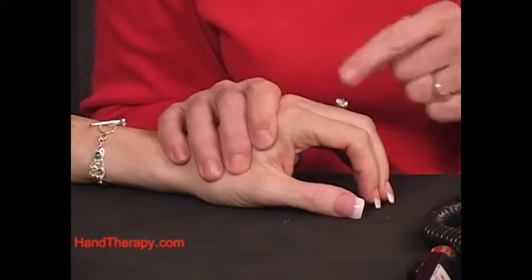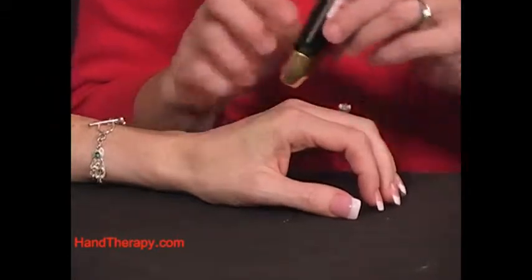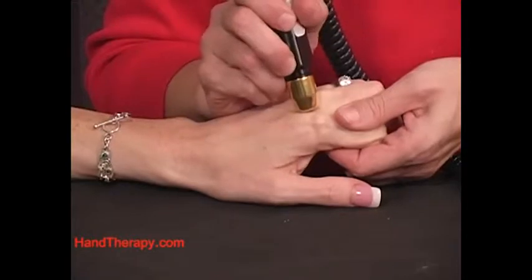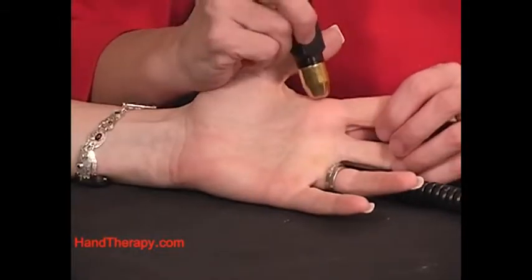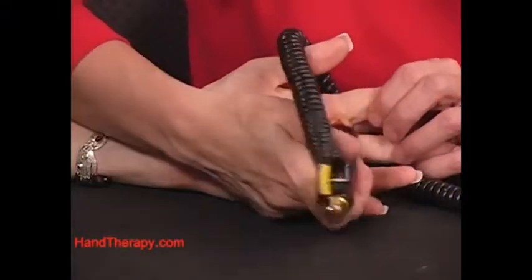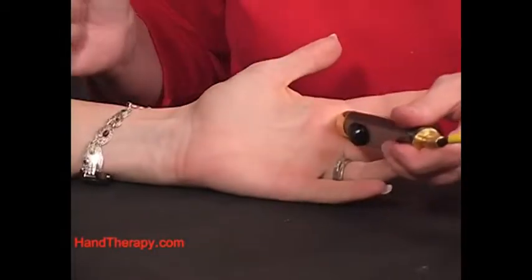I'm going to treat this 3 points. And what I mean by that, I'm going to use a single probe, and I'm going to treat per point. So this would be a point, this would be a point, this would be a point on my dorsal, and then on the volar, I'm going to treat 2 points, and I'm going to treat right in this area and then over in this web space, if you can kind of see that, okay?